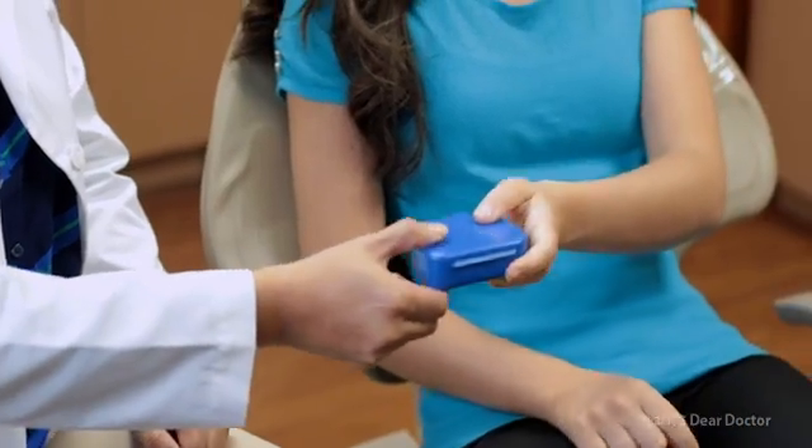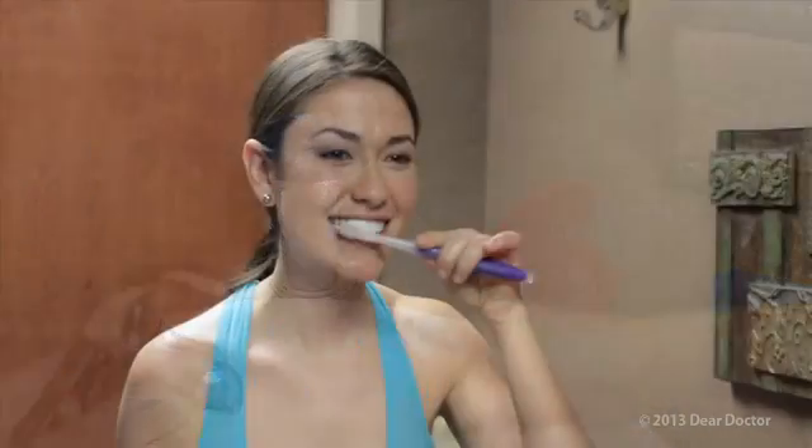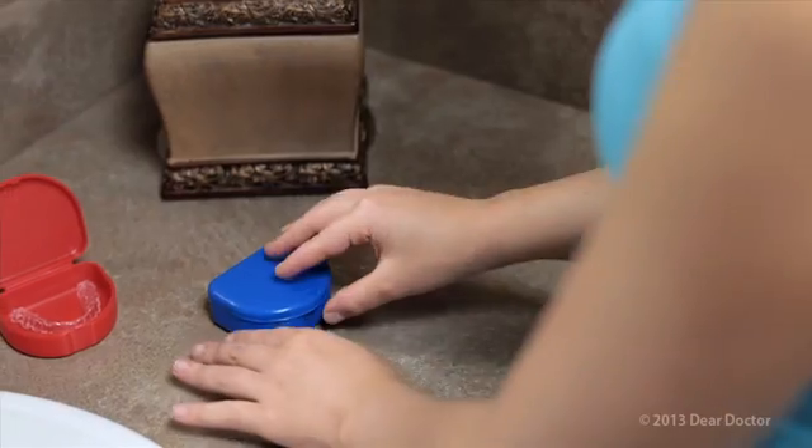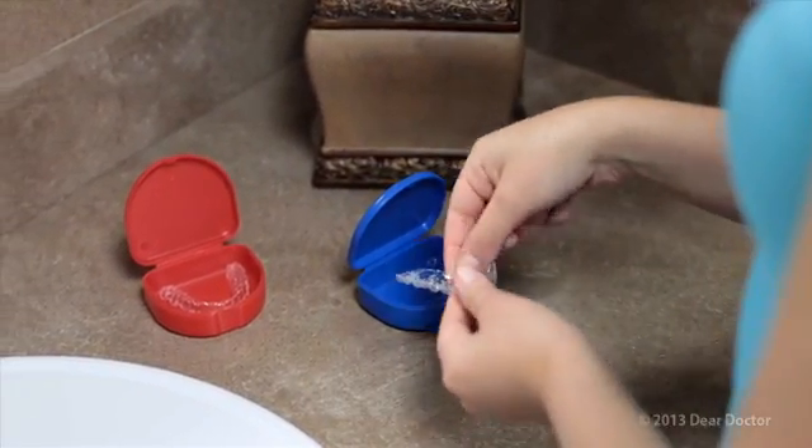Once you receive the trays from your dentist, you will wear the first one for at least 20 hours per day for two weeks, removing them only at mealtimes and when you brush and floss your teeth. Then it's time to progress to the next tray to accomplish the next gradual movement, and so on, until the desired result is obtained.